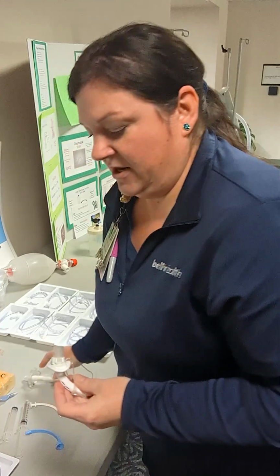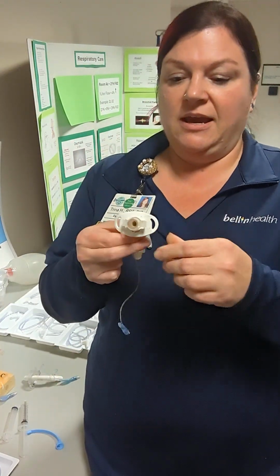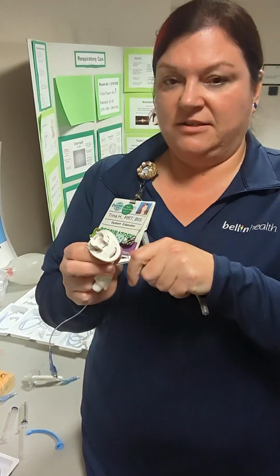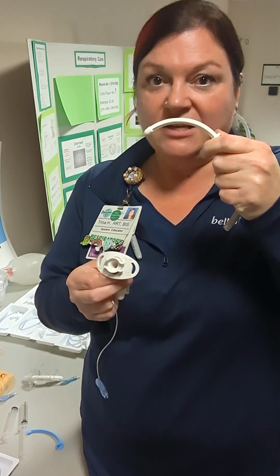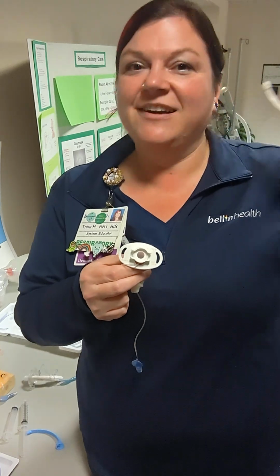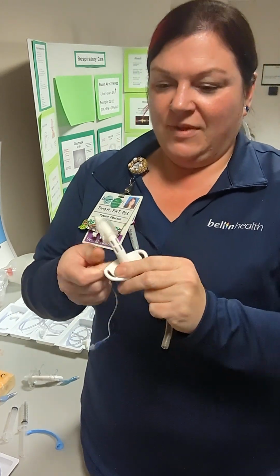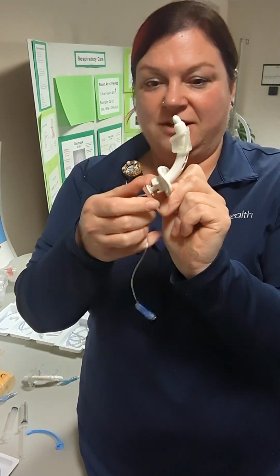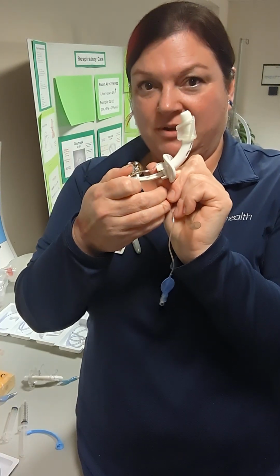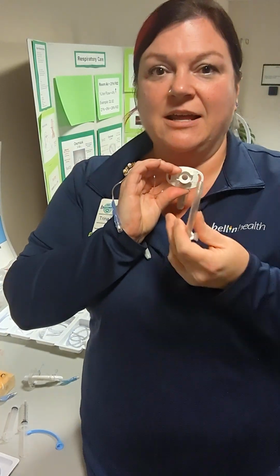Another version of the same thing would be this trach. And again, it has a stylet-type device called an obturator. Hello, obturator? Okay, now try and forget that. So it goes inside. Again, it's a round edge instead of this real sharp, blunted one. So we're going to place our airway, take out the obturator, and then we're going to insert our inner cannula.